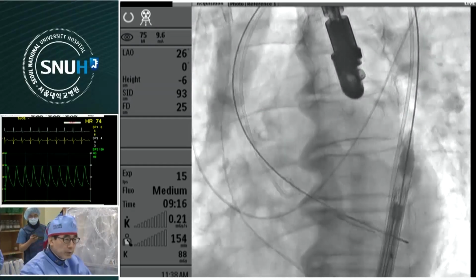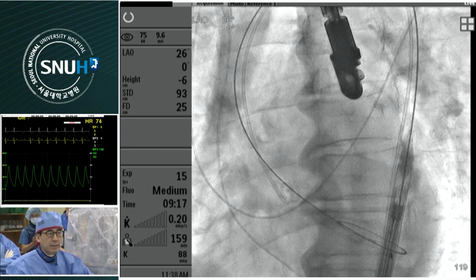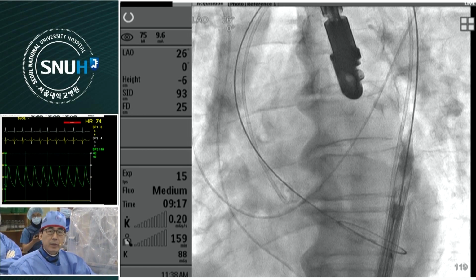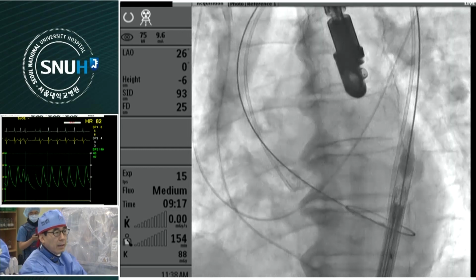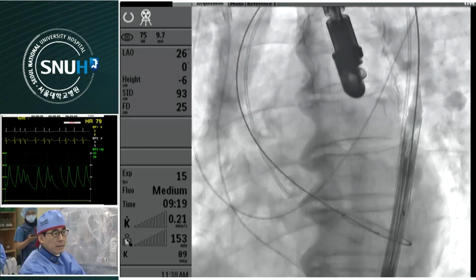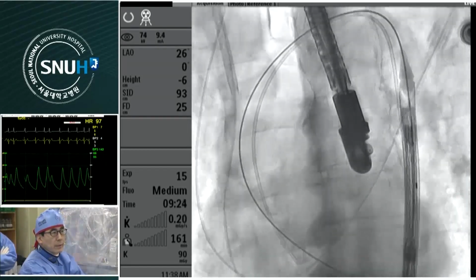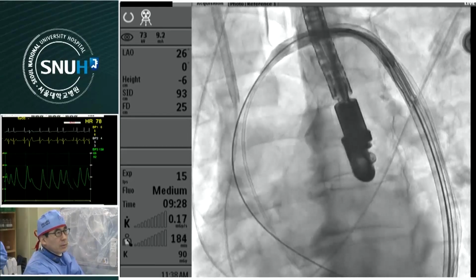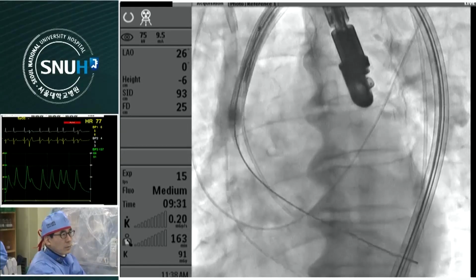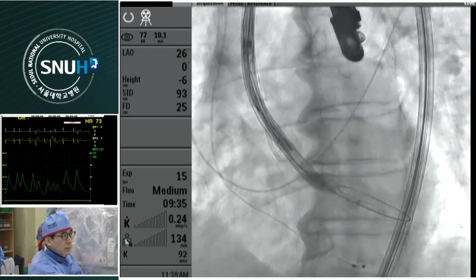This is a very important step because the delivery system is very rigid and thick. It is frequently associated with aortic damage. So it is very important to trace all the aortic wall when it passes through. Okay. I think his comment is good. Please comment slowly, with every tip for the LOTUS valve deployment. It is not a predilation. Okay.